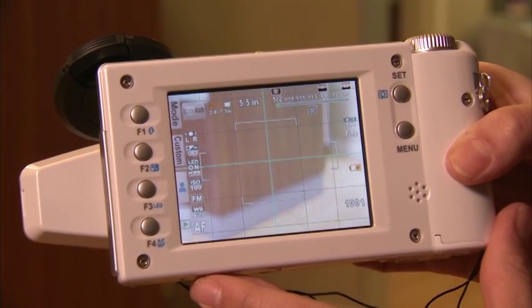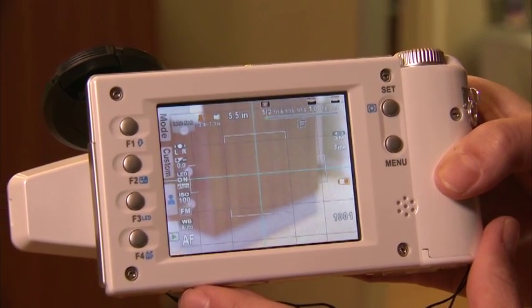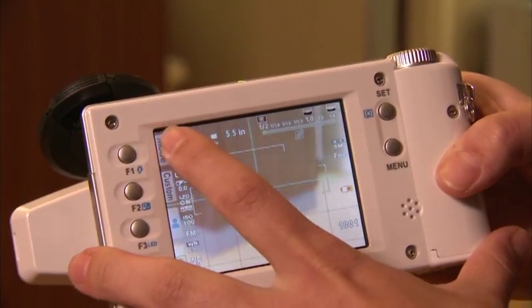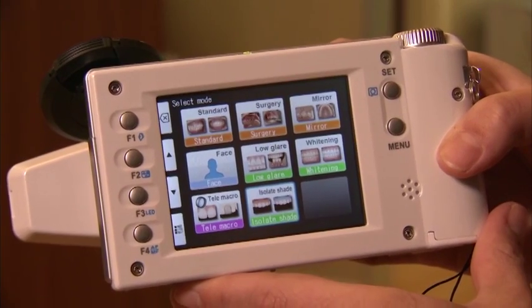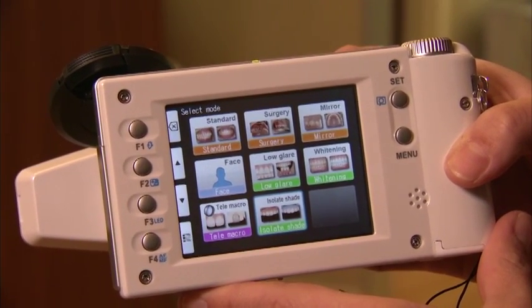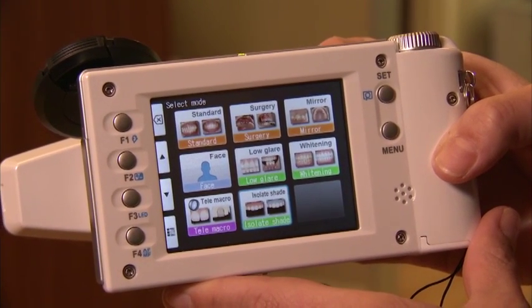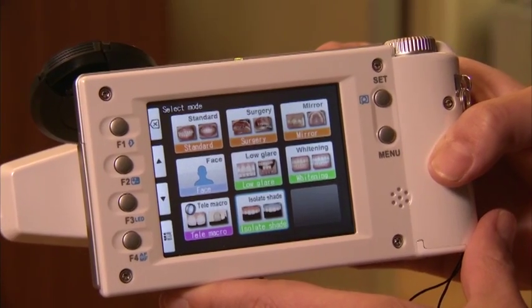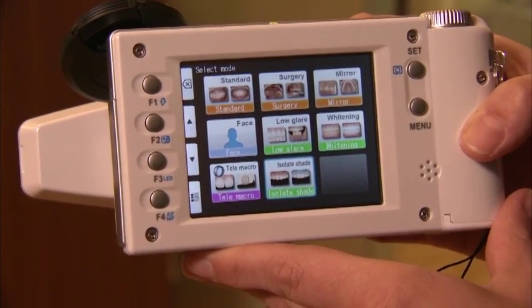With both modes you can hold a shade tab into the picture. The low glare mode takes some of the glare away so you can see the gingival tissues in good form. The isolate shade mode is specific because it will essentially gray out all of the negative space — the soft tissue and everything around it — so you can see specifically the chroma, color, and contour of the individual teeth.